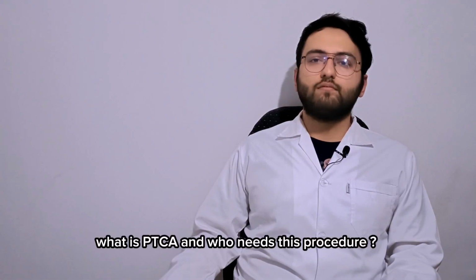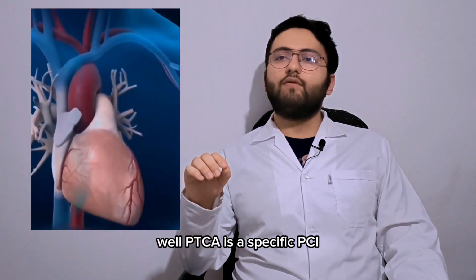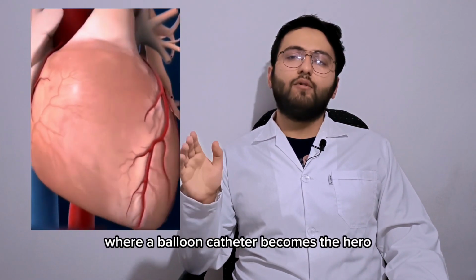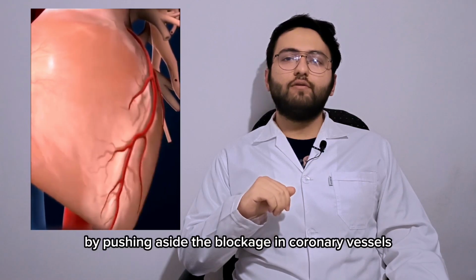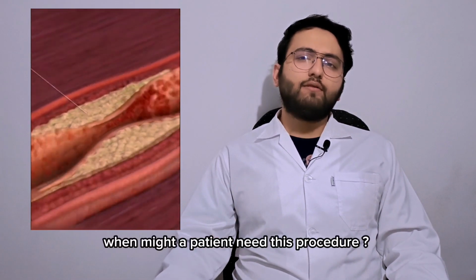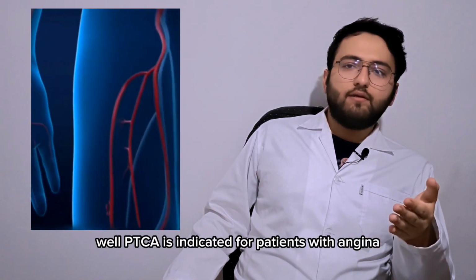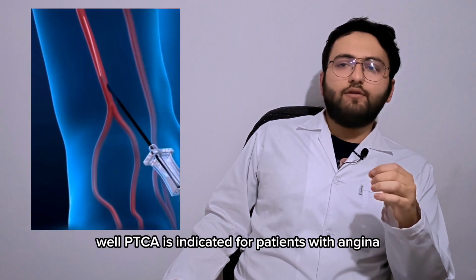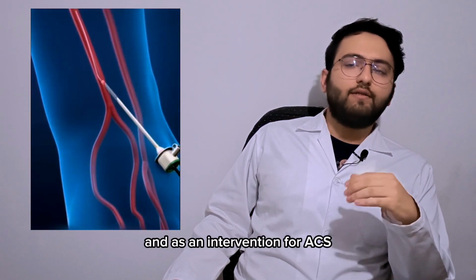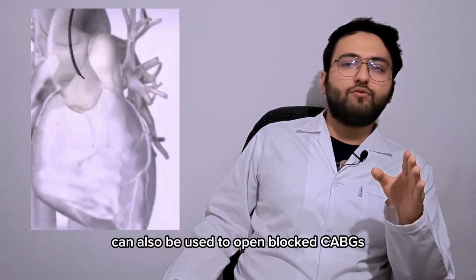What is PTCA and who needs this procedure? Well, PTCA is a specific PCI where a balloon catheter becomes the hero by pushing aside the blockage in coronary vessels and resolve ischemia. Now you may ask, when might a patient need this procedure? Well, PTCA is indicated for patients with angina and as an intervention for ACS. Catheter-based interventions can also be used to open blocked CABGs.